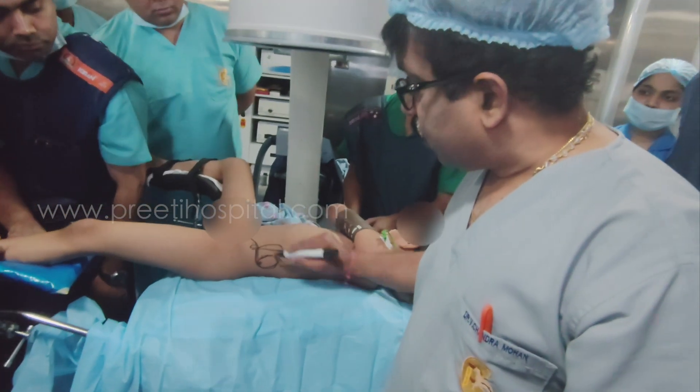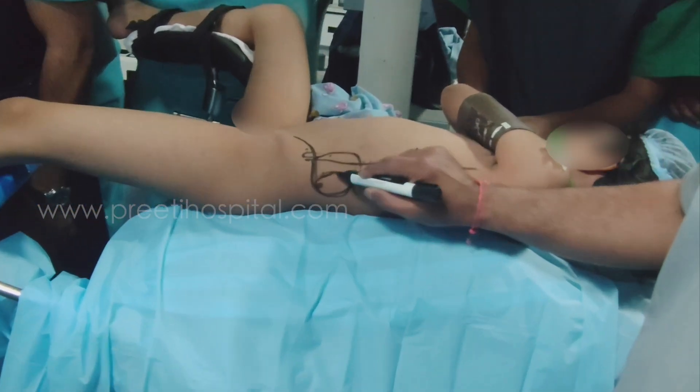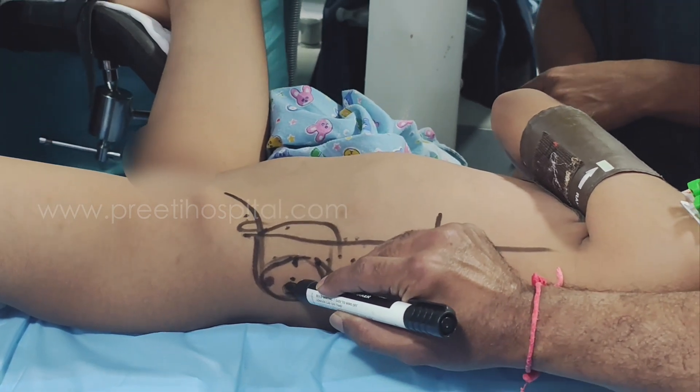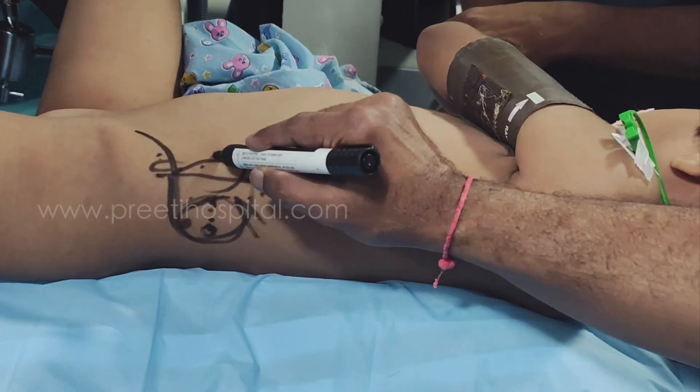Posterior axillary line versus 12-3 (12th rib tip) — I feel 12-3 is better. At 12-3, one or two finger-breadths below the rib tip: if you start your puncture there, it is better. Go up and get it. If you start around the posterior axillary line, you may be in trouble.